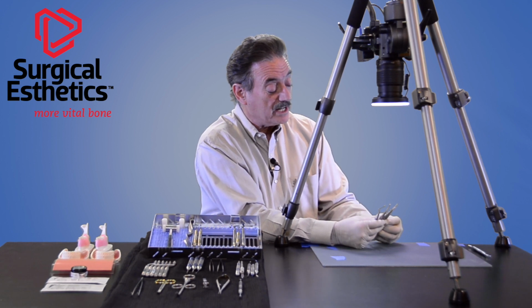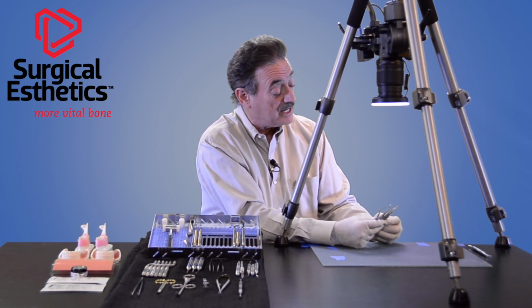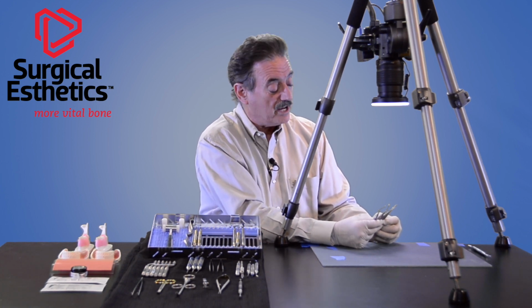If we leave that granulation tissue behind and we're trying to graft that area, we're not going to get the same kind of healing and the same kind of bone growth that you would if we have a completely clean socket.